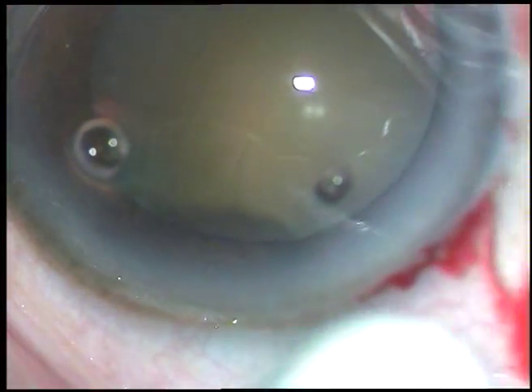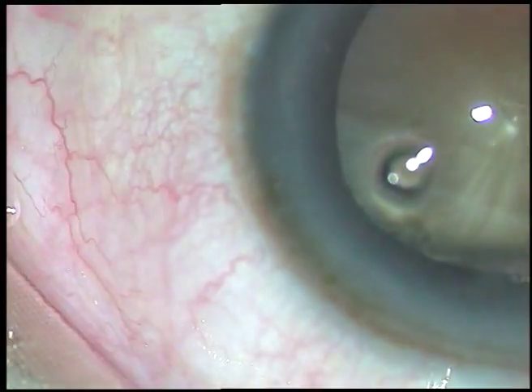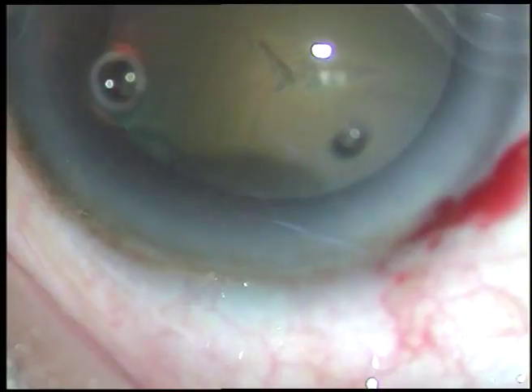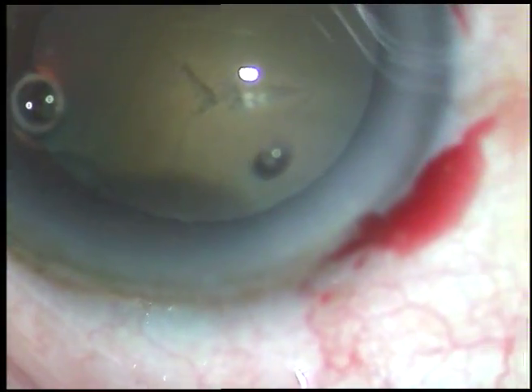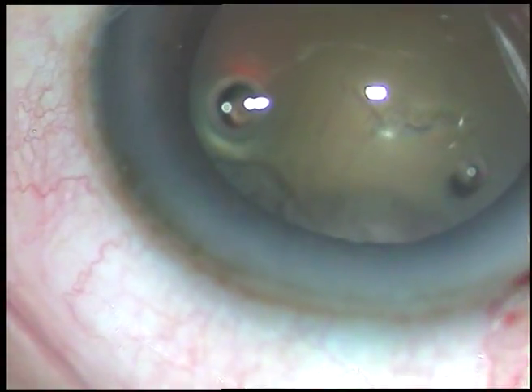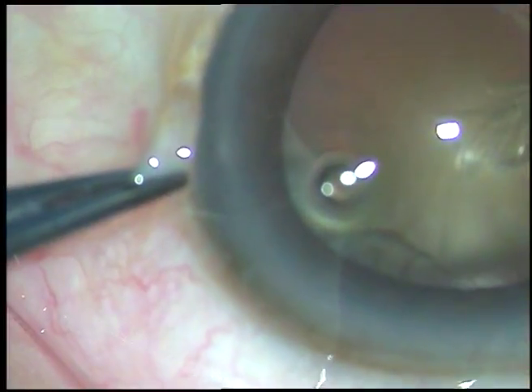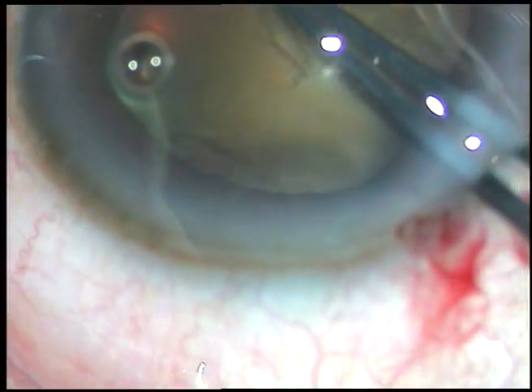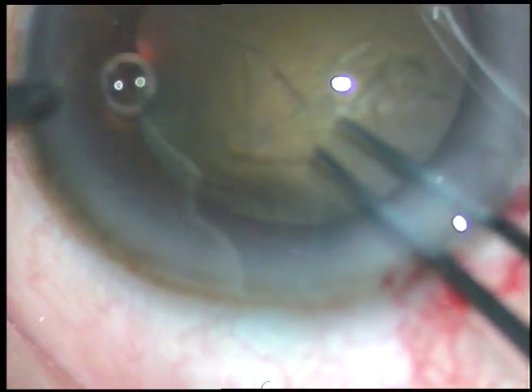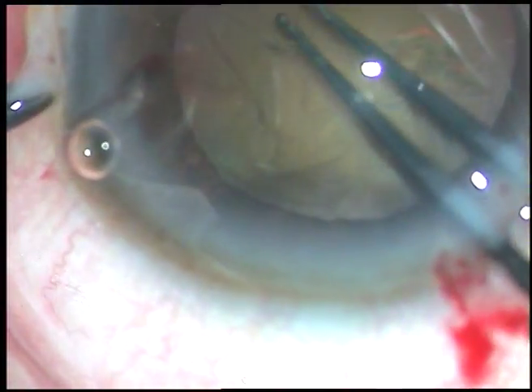Now capsulorhexis is done. The capsule is incised with a 26-gauge bent needle. Utrata forceps is used to hold this capsular tag, and then after holding the tag I move anticlockwise and perform CCC — that is continuous curvilinear capsulorhexis.